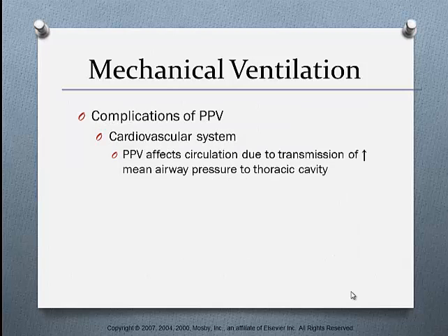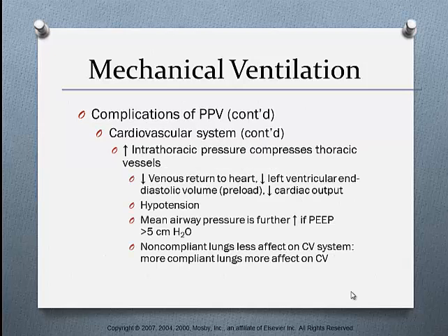Here we're going to go through the complications of PPV. PPV affects the circulation due to transmission of increased mean airway pressure to the thoracic cavity. You can go through and look at the complications of PPV.